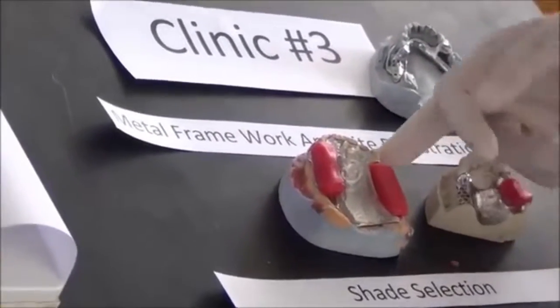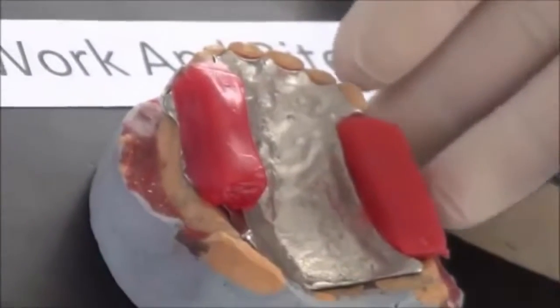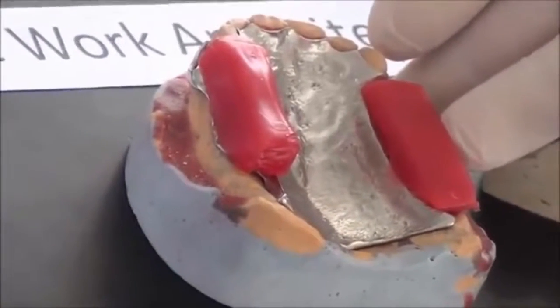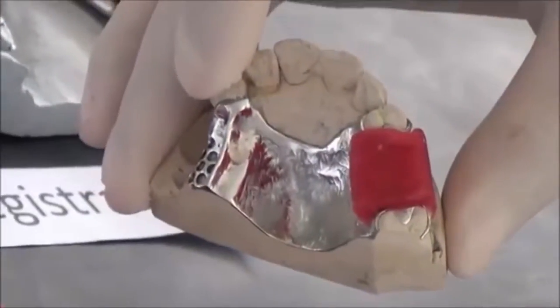So we make the wax blocks according to the instructions you have been given in your lab. We are going to do the same clinical steps that we're going to do in the clinic. But for the bounded saddle area, we simply place a block of wax and tell the patient to bite on it. This is called a bite record.